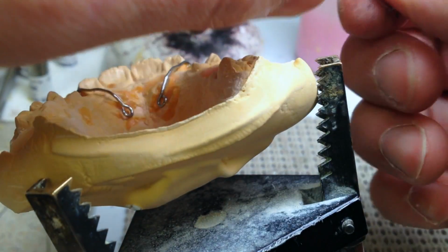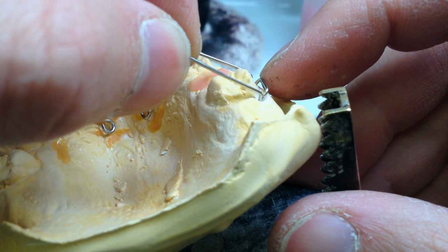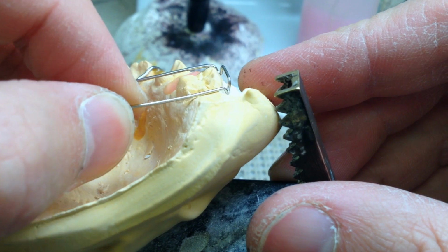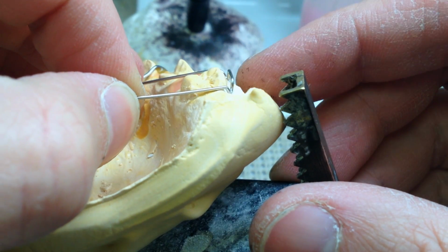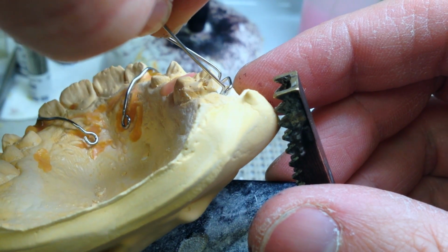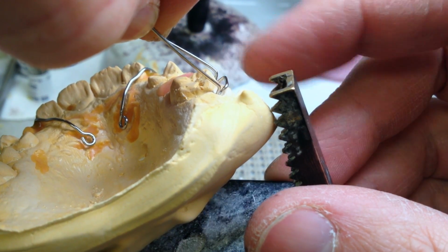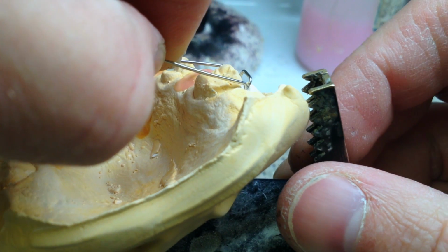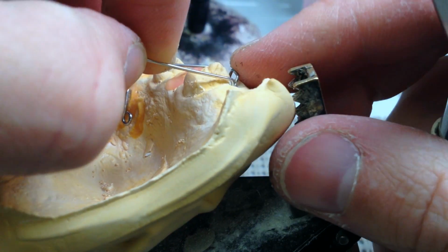With your goal, it needs to be here, this angle. Not here, although I've seen it like that and they still work, but 45 is the ideal.